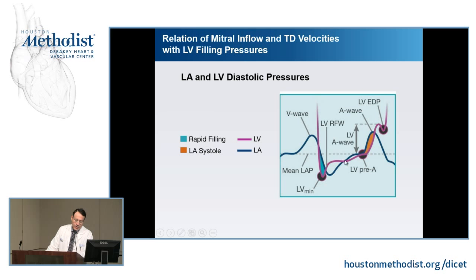The diastolic pressure reaches a plateau, then gradually rises till late diastole when the atrium sends another surge of blood that produces what we call an A-wave rise in LV diastolic pressure, and it ends up with the EDP. So the pressure that is frequently reported in cath reports is the EDP, end diastolic pressure. As you see, it stays for a very short duration of the cardiac cycle. And end diastolic pressure is abnormal in patients who have diseased hearts, diastolic dysfunction, or abnormal intravascular volume status.